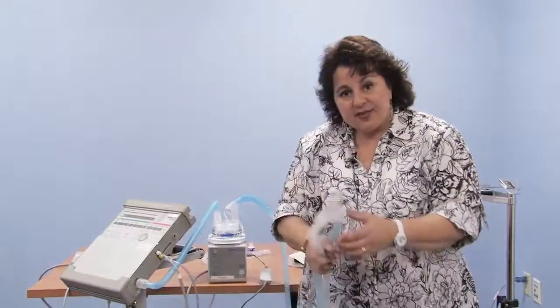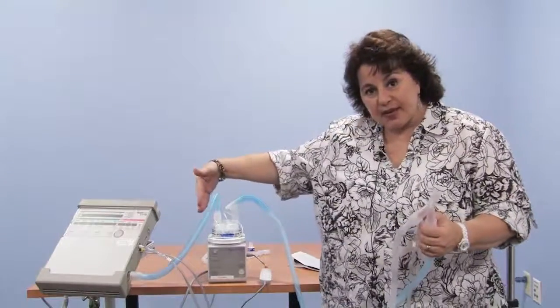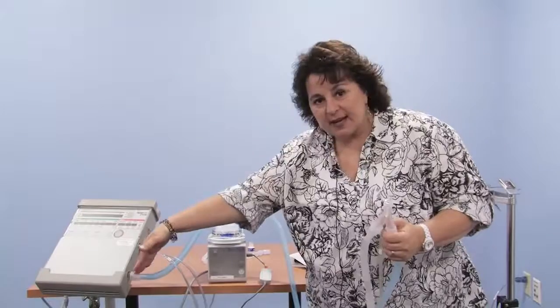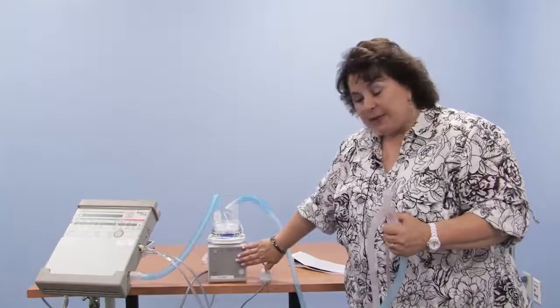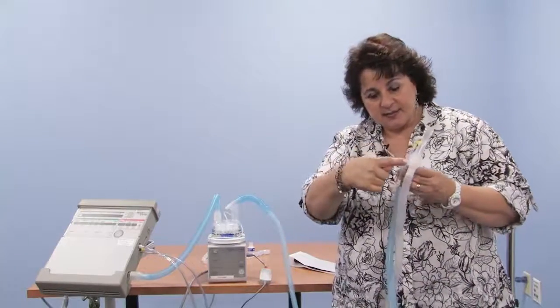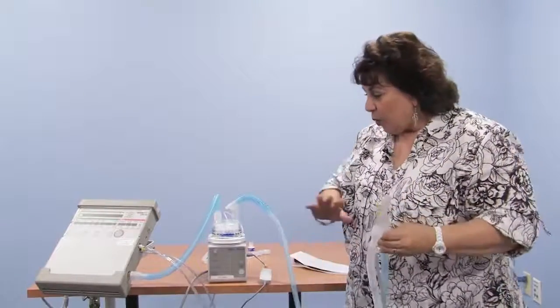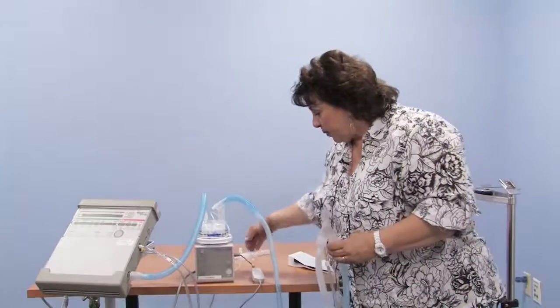And now we have set up the hoses out of the package for the LTV series ventilator with heated humidification. So we went from the gas outlet into the humidifier, maybe a different brand than you see here. We went out of the humidifier, up past the tracheostomy tube, and out the exhalation valve. What we haven't added, but we'll do now, is a few more parts for the humidifier.